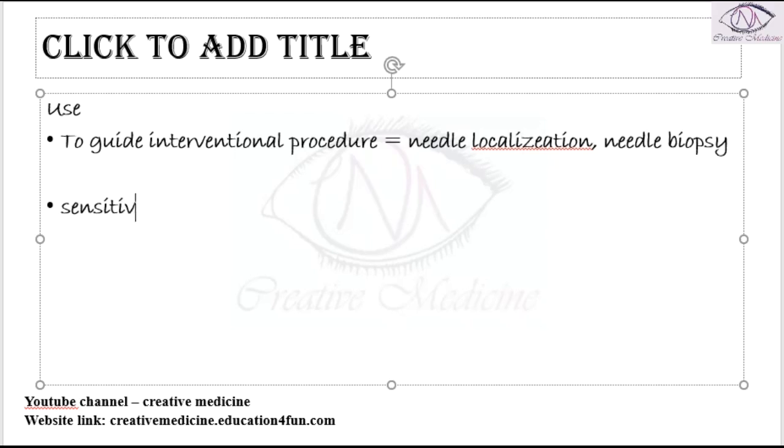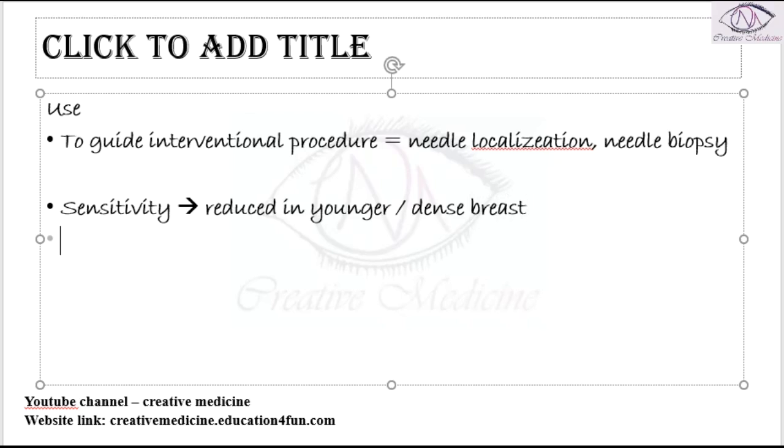The sensitivity of mammography is actually reduced in younger patients, because the breasts are dense. As a result, the mammography will not give a proper reading, so it is not indicated in patients who are less than 35 years of age.